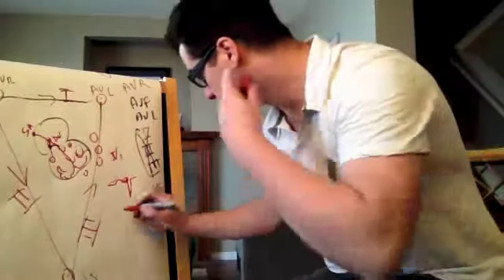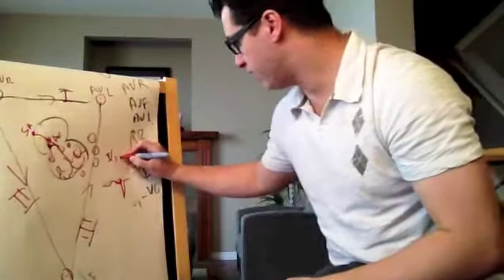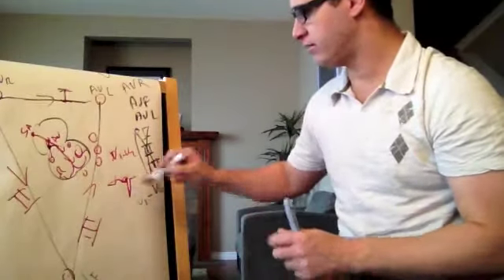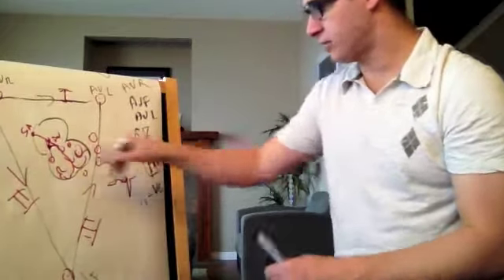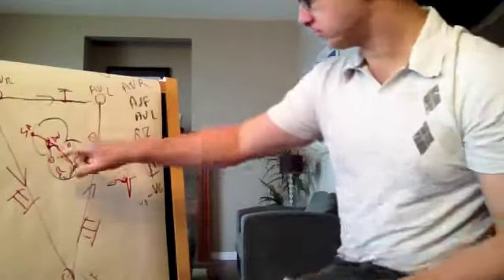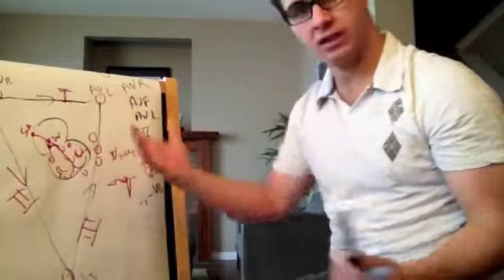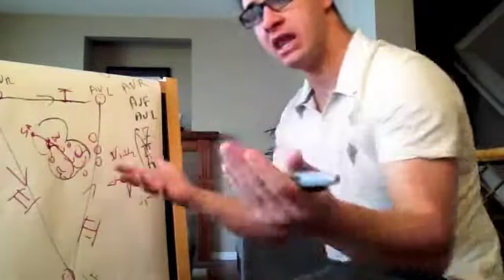V2, a little bit the same. Actually, we'll say V1, V2 because they kind of look a little bit the same. They'll have maybe a little bit, but if you look, they're kind of side to side. So now V3, see how V3 is right over here? So that means, again, rule number 2, where electricity comes towards me, positive, electricity going away, negative.